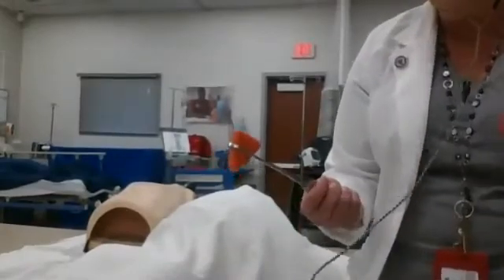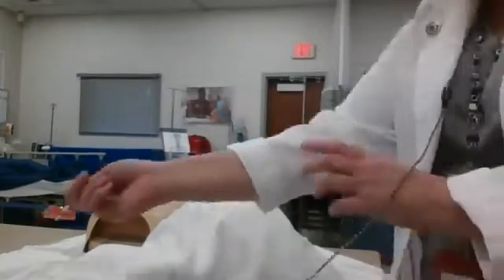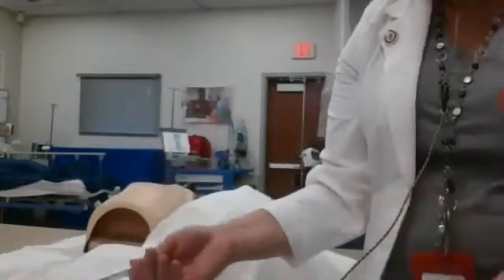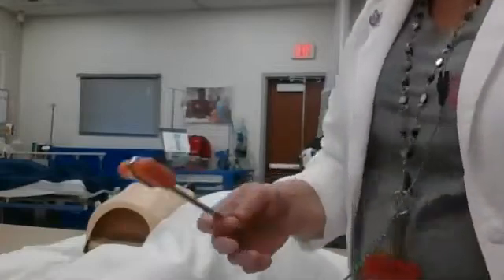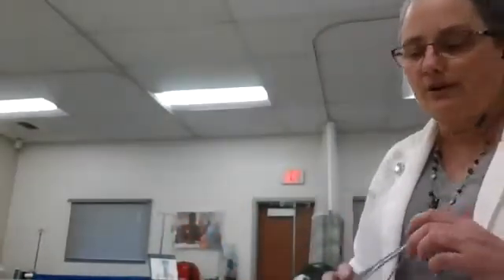When we're doing a focused assessment, we're obviously going to be taking our vital signs. We don't have CNAs on the OB floor — that's something we do ourselves. Then we are going to listen to her lungs and listen to her heart with the stethoscope, and then the fundal height which I already showed you. We would also use a reflex hammer to check her reflexes, and we will be testing this on each other in the clinic site. We want to make sure we know how to look at patellar reflexes and the reflexes you can get on your arm — knowing her baseline is critical. Lastly, we're going to check for clonus, which is fairly unique to labor and delivery and looks at the excitability of her nervous system.